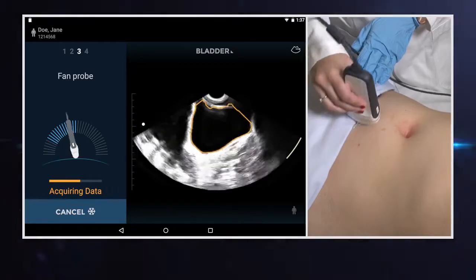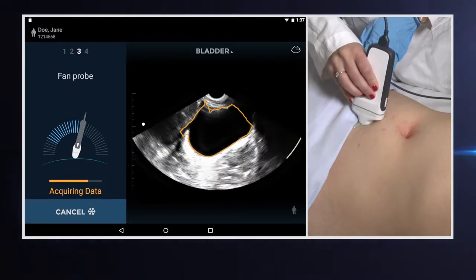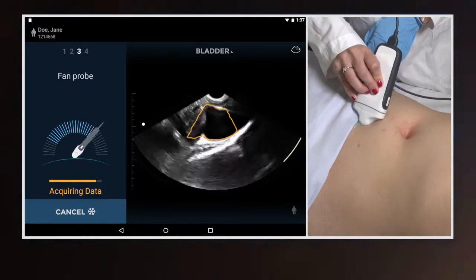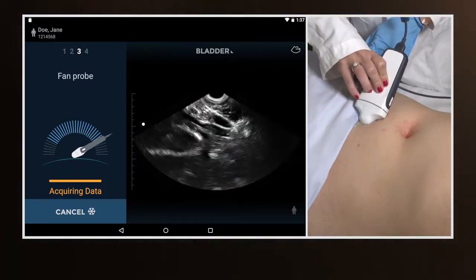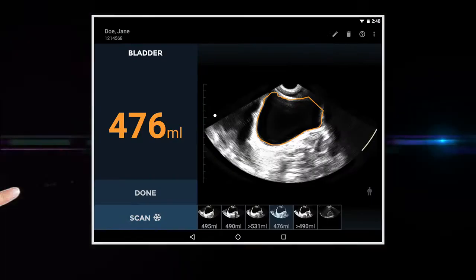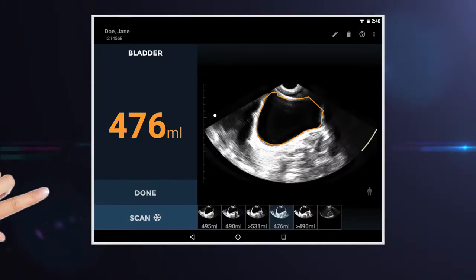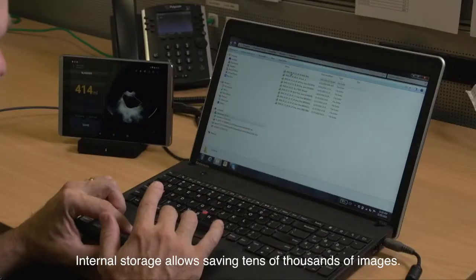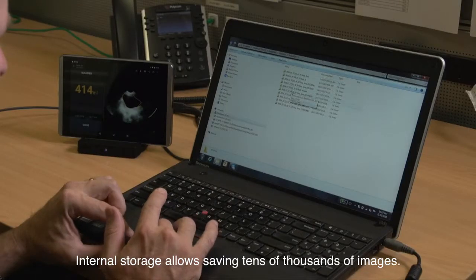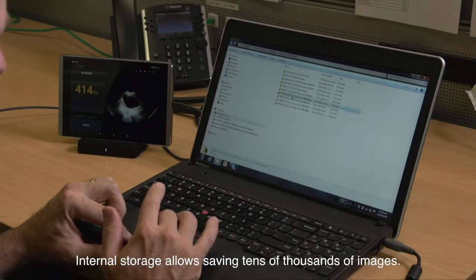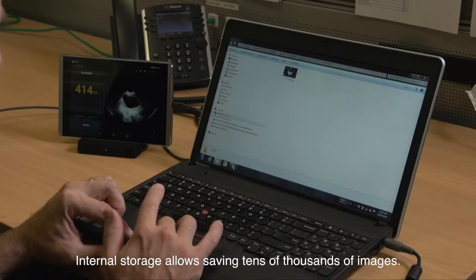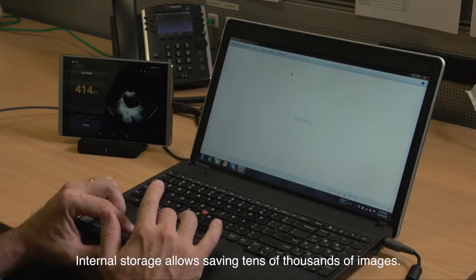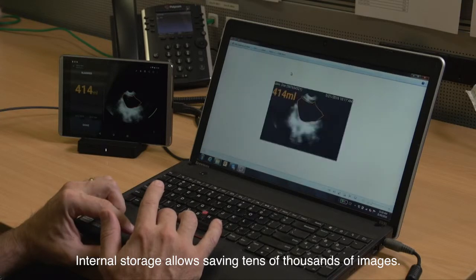The device can be configured to suit the needs of your individual clinical practice with various cloud and EMR connectivity options. An internal storage option allows you to save tens of thousands of images.